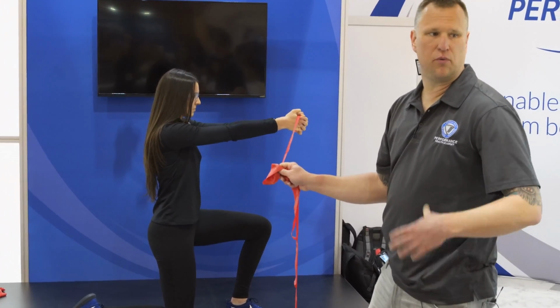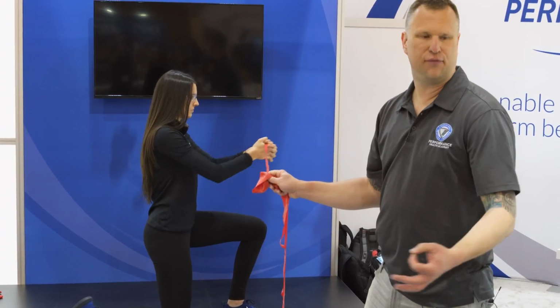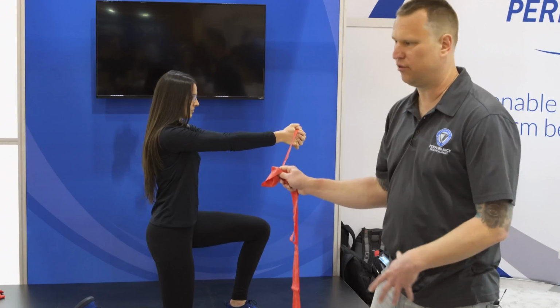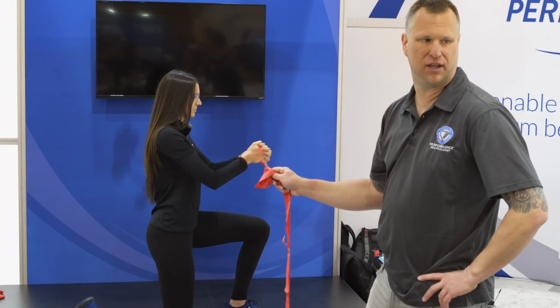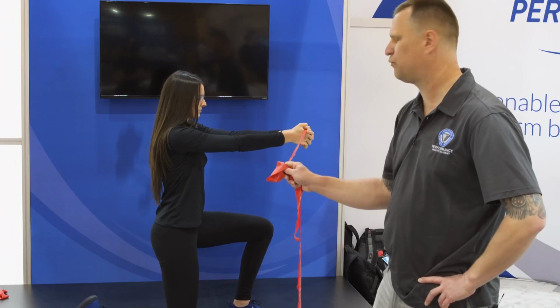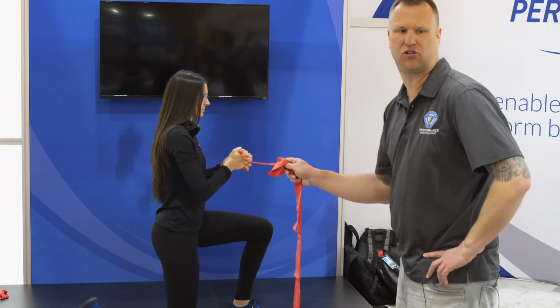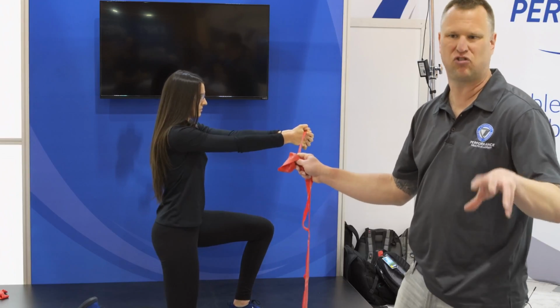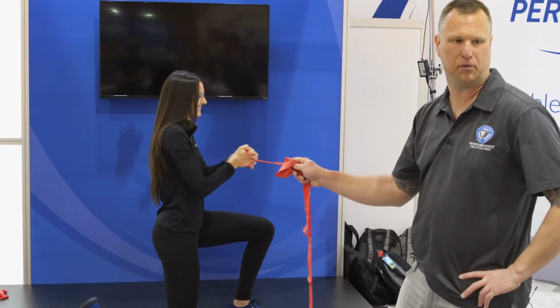Guys, this exercise, what we would call a core push out, is significantly engaging her abdominals right now, her hip extensors, all the hip adductors, the hip abductors on both sides. Her foot, if we were to keep doing this on her left side, that's closed chain, her toes and intrinsics of those feet are going to start digging in. They're trying to essentially grab and stabilize through there.